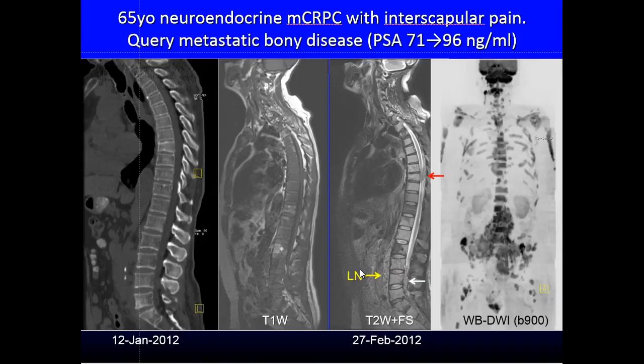And I just thought I'd show you one example of this. So here's a patient with retroperitoneal lymph nodes on this diffusion scan, and again we will come back to what the diffusion scan shows us and how that technology works in a few minutes. But you can see that there is so much disease. There is very little in the way of normal marrow remaining on the morphological MRI sequences, on the diffusion images. But if you were to look at the CT scans, that completely underestimates the amount of disease that's there. You can see it, but it completely underestimates the amount of disease that is there.